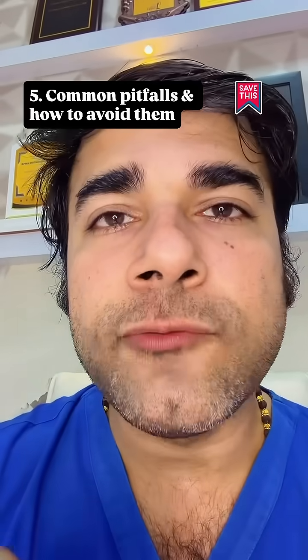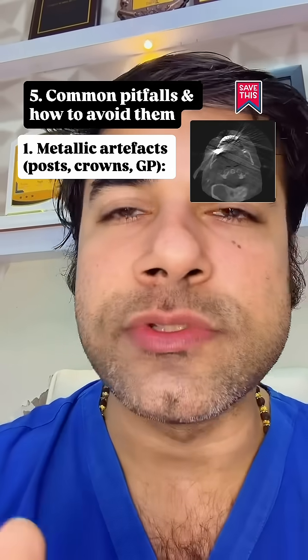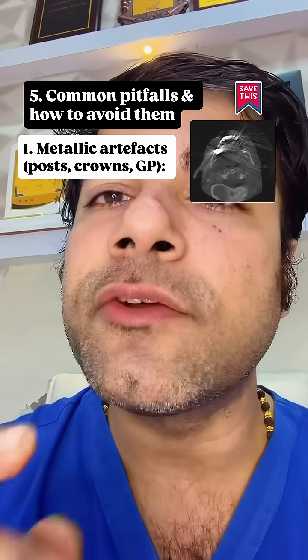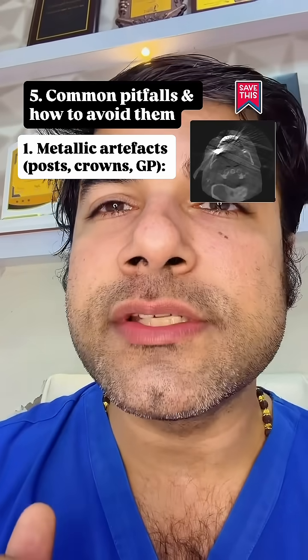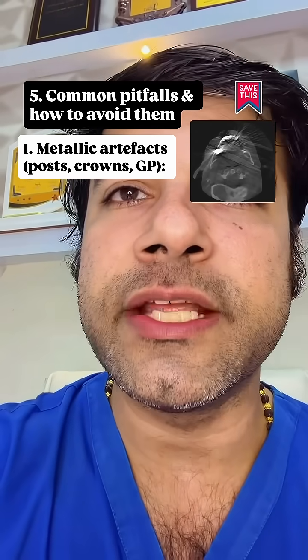5. Common pitfalls and how to avoid them. Number 1, metallic artifacts. Posts, crowns, gutta-percha can create linear streaks that mimic the fractures or mask the fractures. Read the slices immediately above and below. True fractures stay in alignment with the root. Artifacts often change position and orientation.